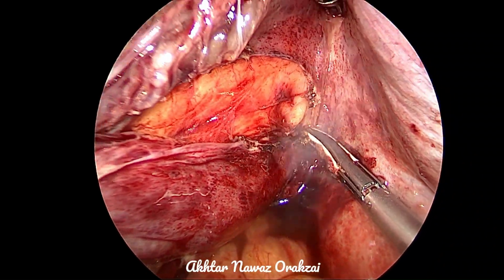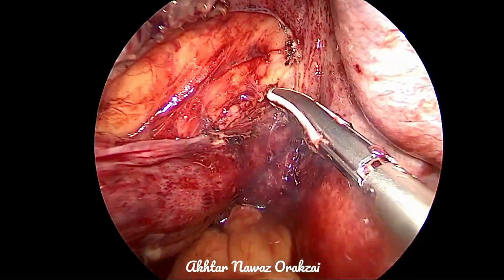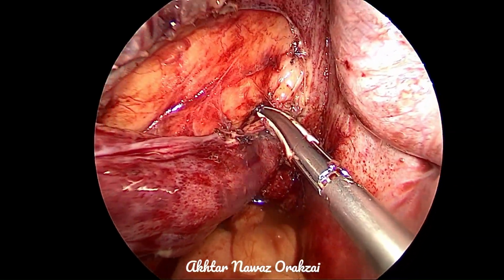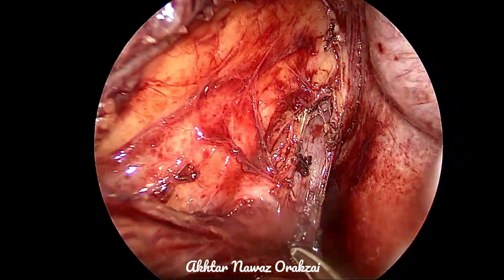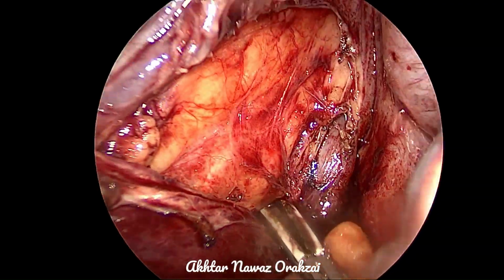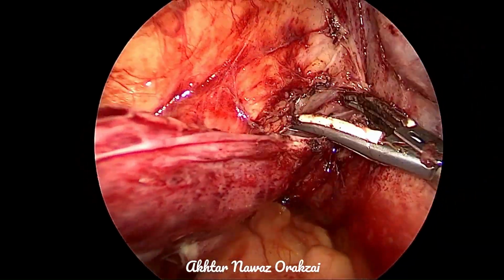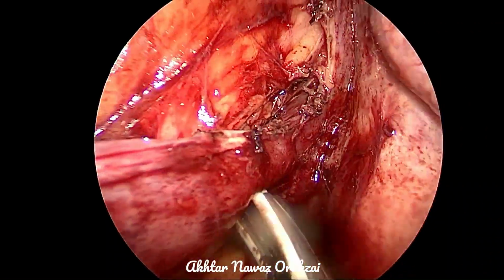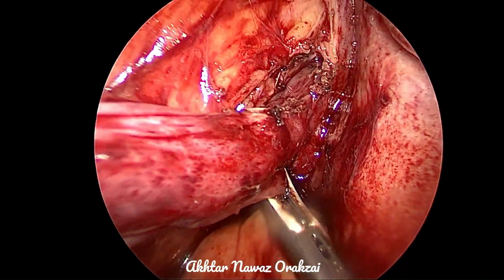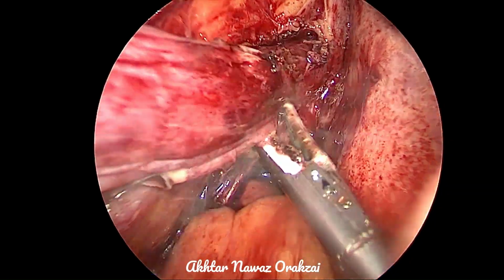Care must be taken for the internal iliac vein because usually in this area where there is ligation, there is leakage of urine and a lot of fibrosis, so at times the vein is strongly adhering to this part of the ureter.